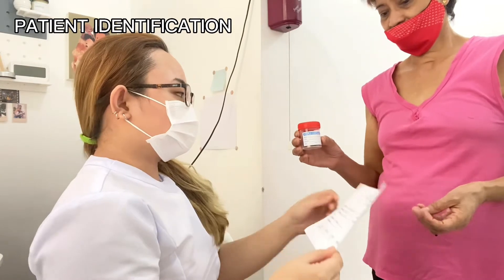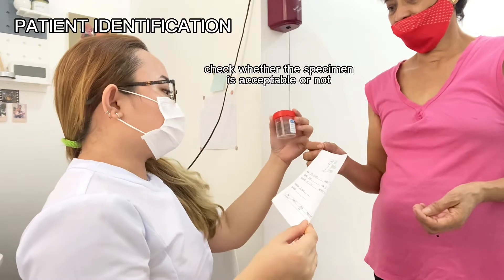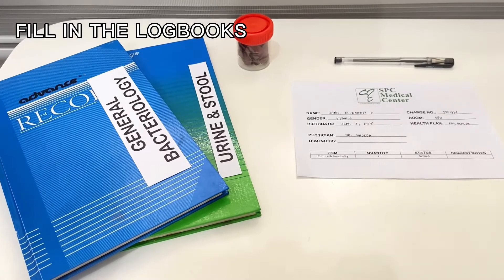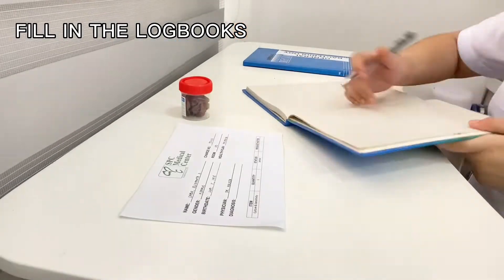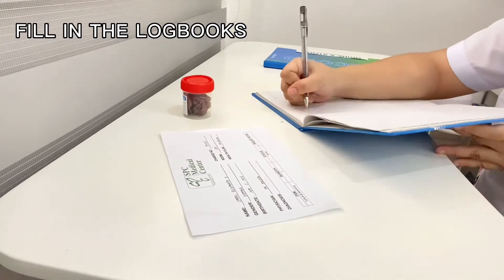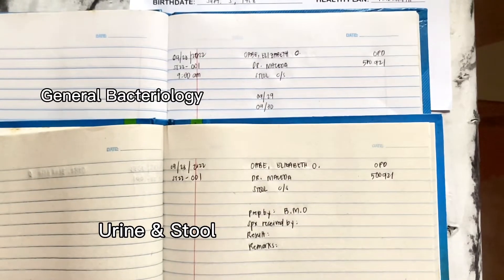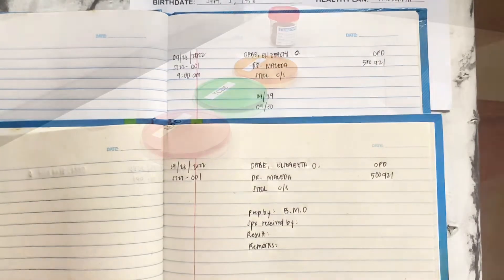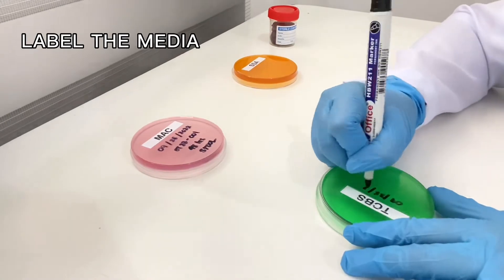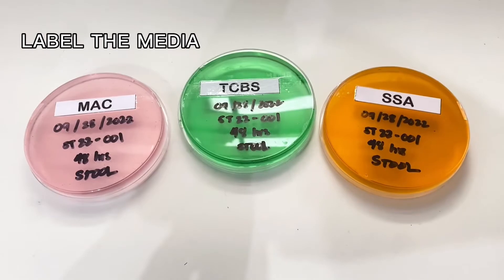For patient identification, check the request form and check the specimen whether it is acceptable or not. Fill in the general bacteriology and urine in stool logbooks. Then gather all the materials and label the media by writing the date of collection, control number, number of hours of incubation, and the specimen to be tested.